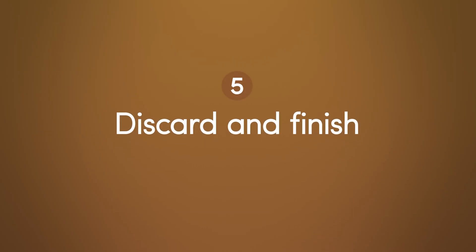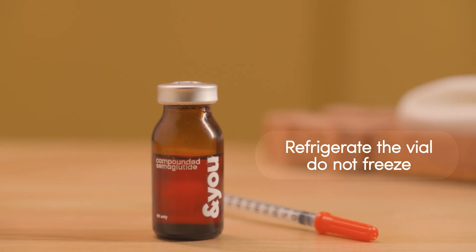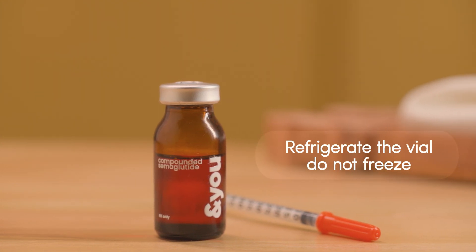Finally, discard the syringe immediately in a safe, hard-sided container with a lid. You can use a sharps container or even an empty laundry detergent bottle. Do not attempt to recap the syringe, as this can lead to accidental needle sticks. Store your medication vial back in the refrigerator for future use, but never in the freezer. Eventually, the vial can be disposed of safely in a hard-sided container with a lid.